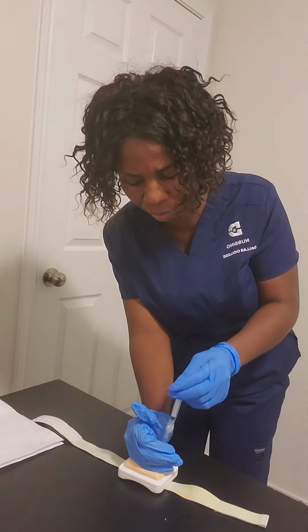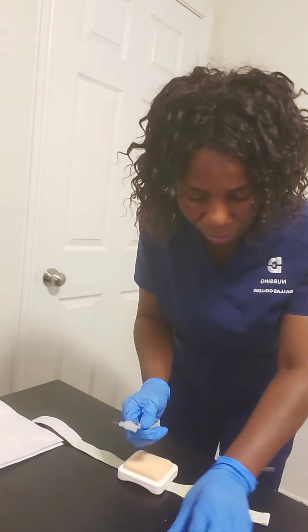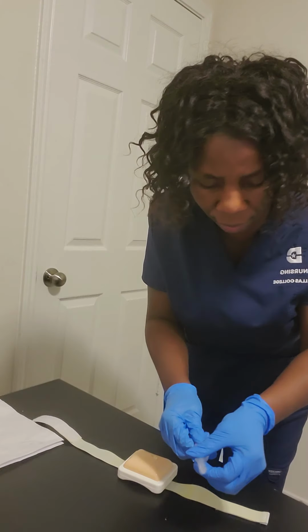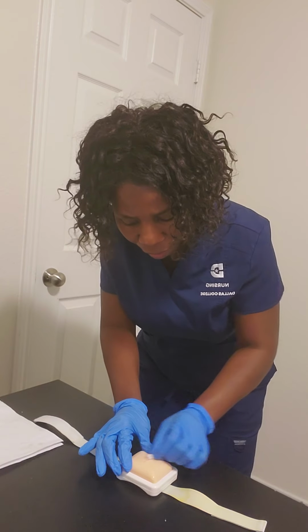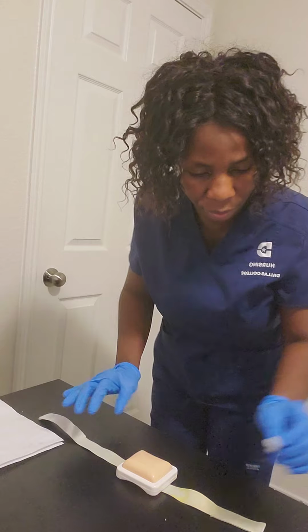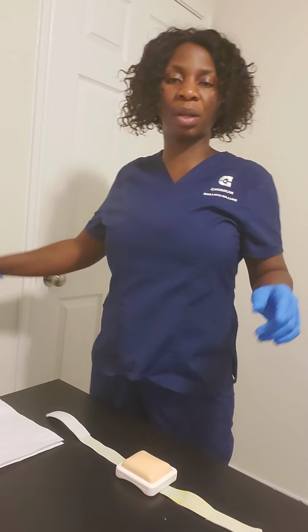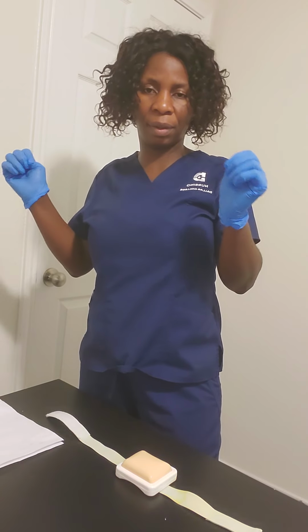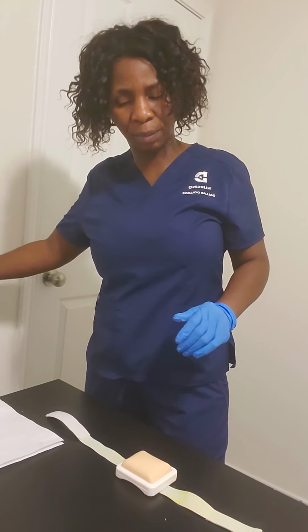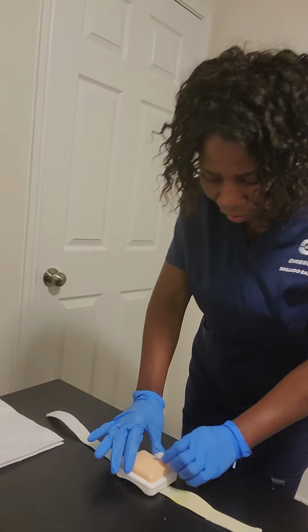So I've been able to administer the injection, and before I do that, I think I should have cleaned, but I'll clean it. In case there is blood, I will make sure I clean very well. I'll put gauze, so I will have cleaned before I administer the last injection too, and I'll make sure I perform hand hygiene before I do that. Since I already have my glove on, I just must mention it. I must perform hand hygiene and do the necessary thing. So after administering the injection, I'll clean.